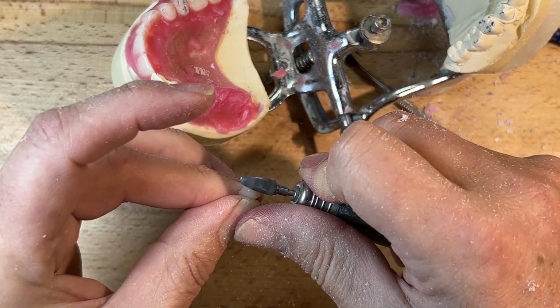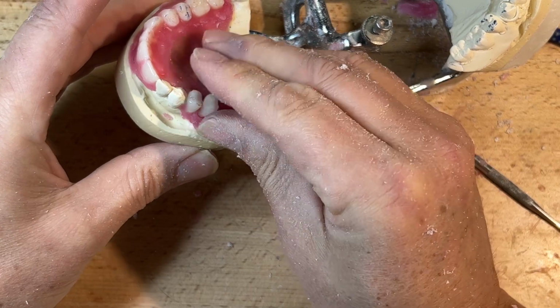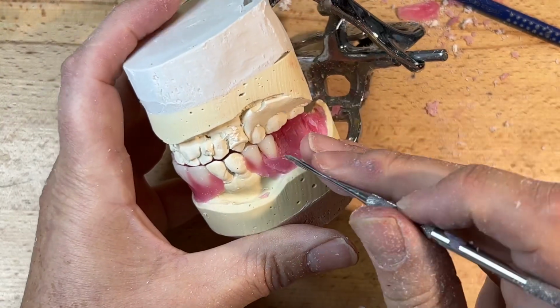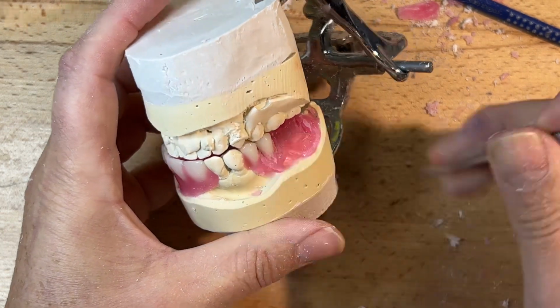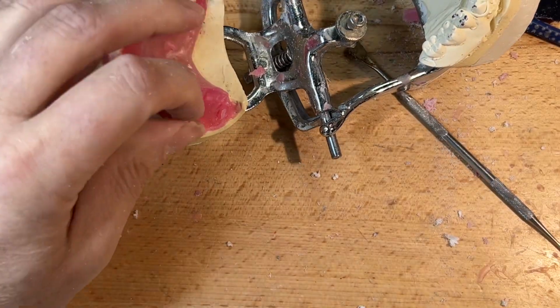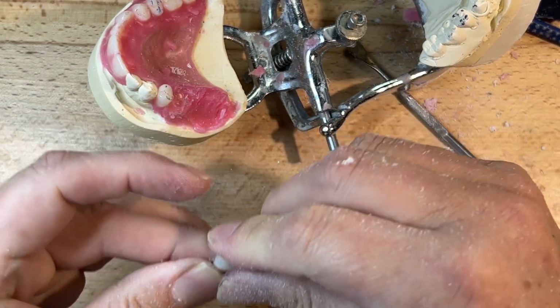It'd be nice, like I said, if we could control upper and lower at the same time. And I'm going to reduce. There we go. Just a touch more. I can use some articulating paper. Reduce this mesial.